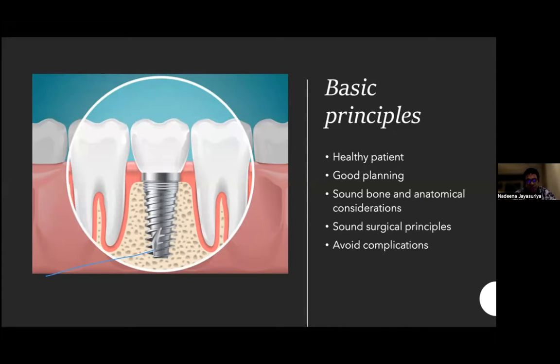Sometimes you have tilted teeth next to the implant. So if you put an implant, there's going to be a very unhygienic triangle between your implant crown and the next tooth. So these are bad things. I'm just trying to point out, I can't tell you everything here. I'm just trying to put your focus on an area where you need to see the occlusion, have a good idea how and where this implant is going to go and whether it will work. So that's good planning.